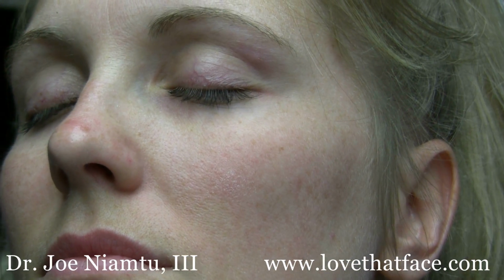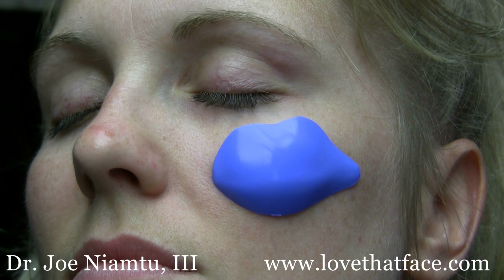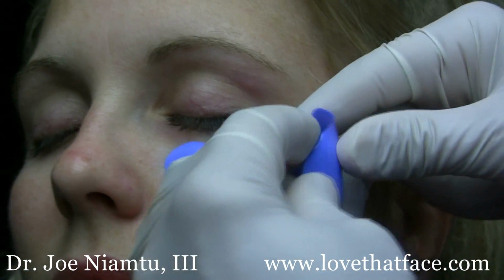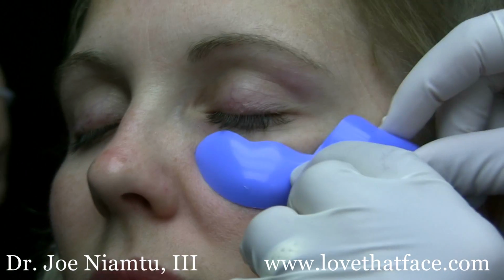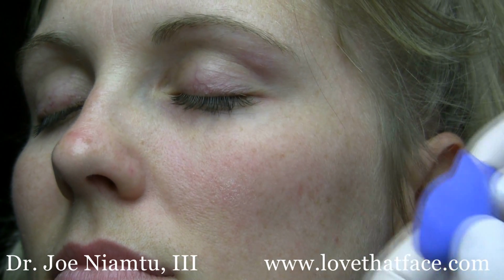The other implant that I use maybe 1 or 2% of the time is the combined submalar shell. Now this implant is kind of a combination of the submalar implant and the malar shell implant. So if you could imagine these things being together, that treats not only this area but the higher cheekbone.